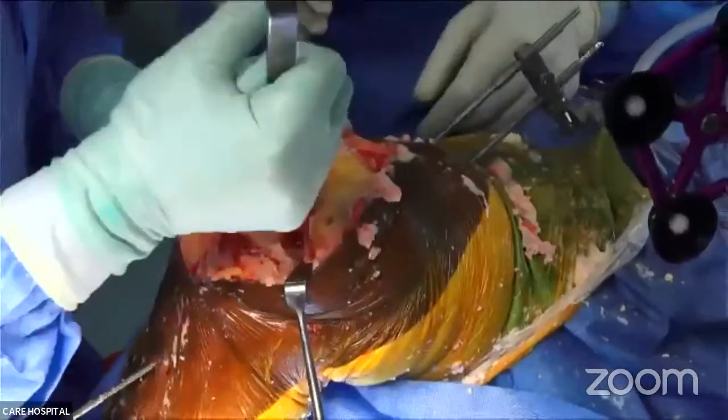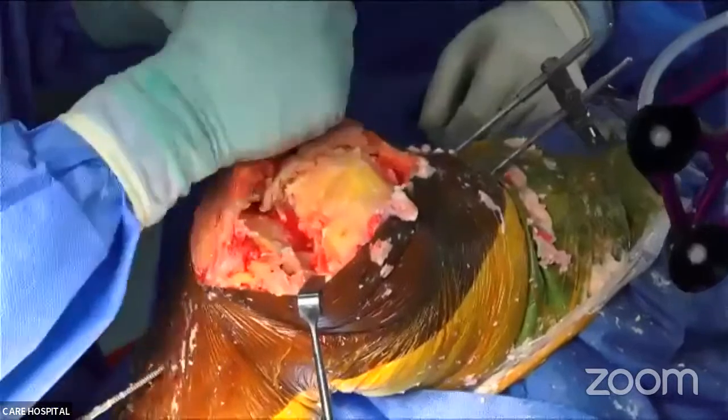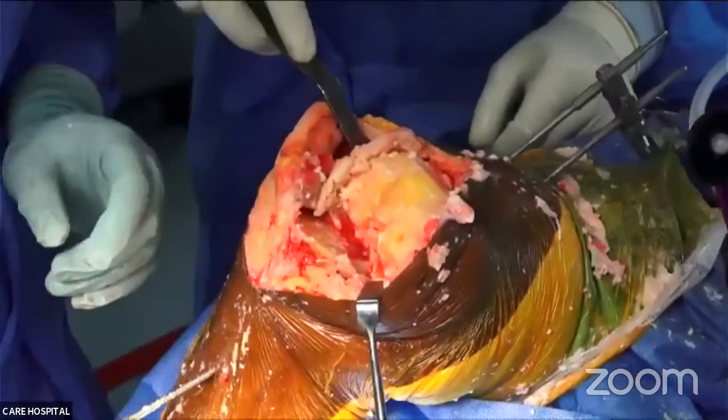These bones we have to remove by ourselves. Nibbler.